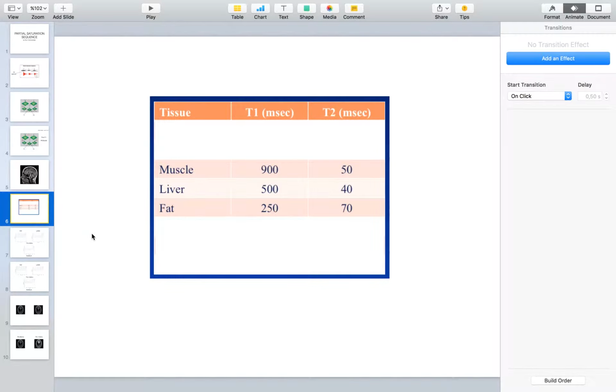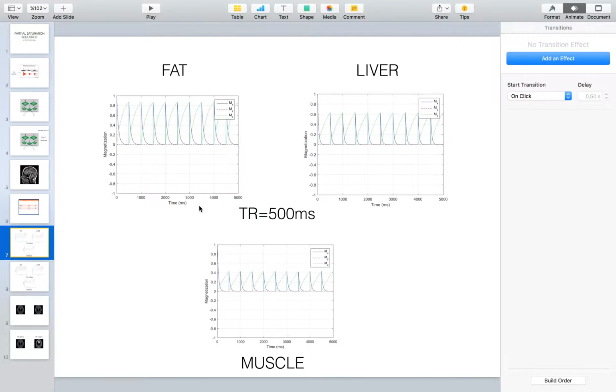Firstly, in MATLAB, I've generated a one-dimensional signal analysis of these tissues. As you can remember, the z component of the magnetization is our main objective here. Let's look at the green curves. In this part, the green curve goes like this, and after the second 90-degree pulse, it goes down to the xy plane and starts to recover with T1.